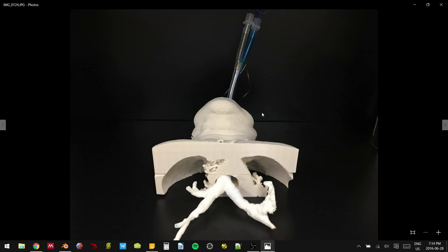Your simulator that you just printed, if you were to follow the tutorial one for one, is very similar to this one and would respond just as well to a bronchoscope and a lung isolation and a double lumen tube. You might have to go down from a 37, as I showed in the video, or you just make your airway just a little bit wider. But that's the general steps that you should take if you wanted to make your own double lumen lung isolation simulation, bronchoscopy simulation trainer.